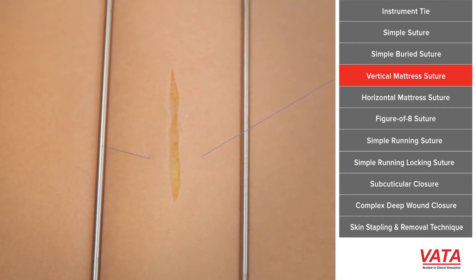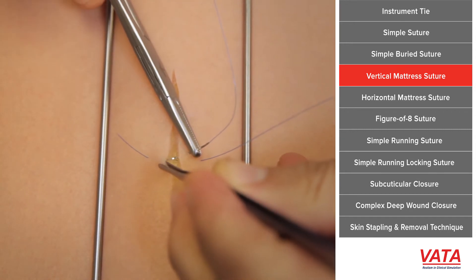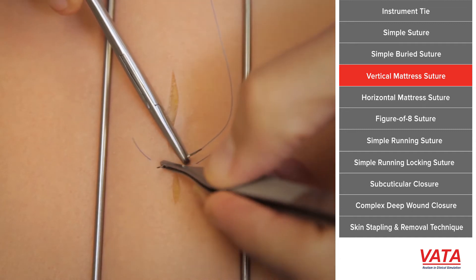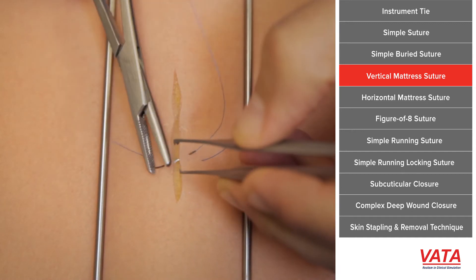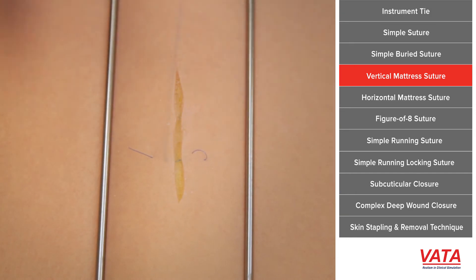Notice I've gone into the skin, along the bottom of the skin and gone far away. And now I turn the needle around and come back and do nearer and nearer to the incision. What this does is it's going to pull the tissue between each of those throws together, as opposed to just pulling the edges of the skin together.